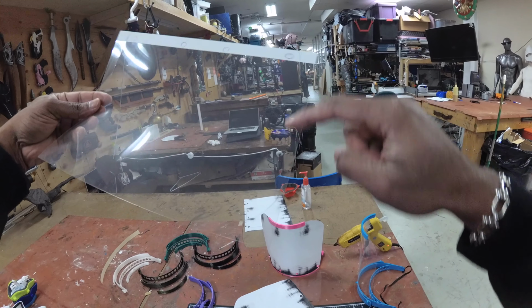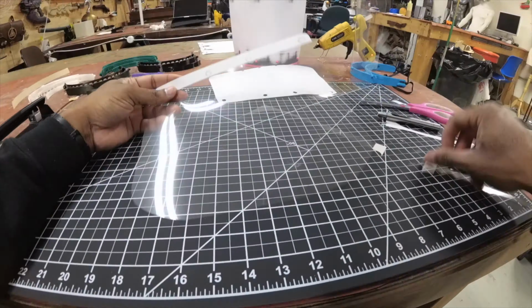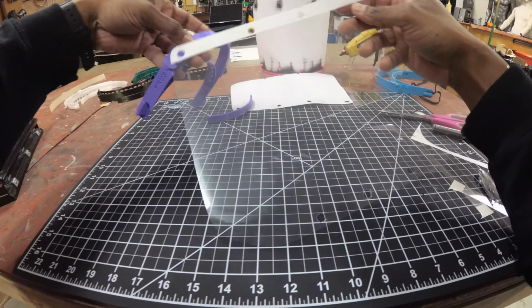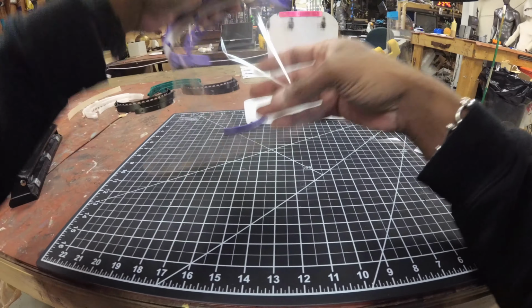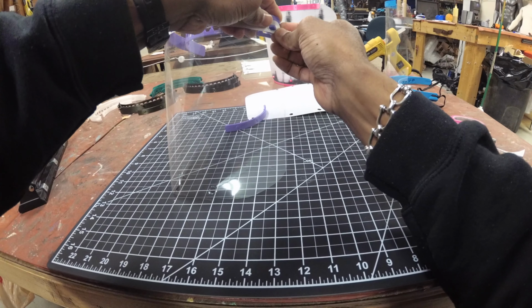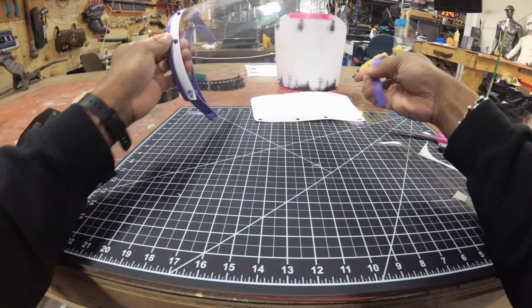Not sure if you guys can tell, but my marks actually did show up with the pen, so that works out. So now we're just gonna do the same thing that we did with the paper, cut out all of our pieces, and then install. Okay, with our final material cut, just gonna go ahead and install onto our 3D printed part. Okay. Just kinda push the 3D print out a little bit. Make sure that it fits in, and then it should be a nice tight fit on your part.